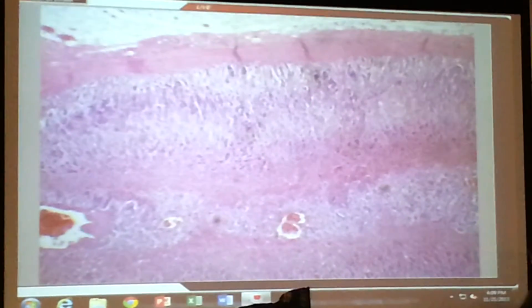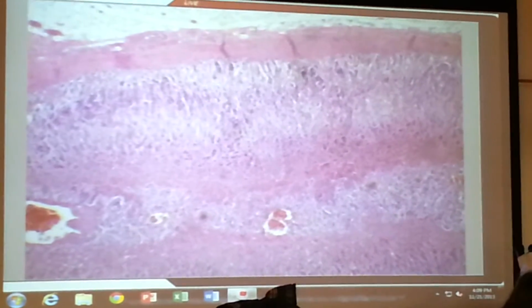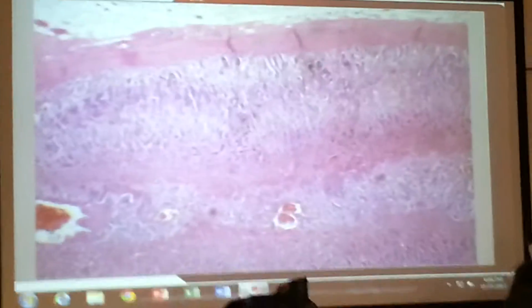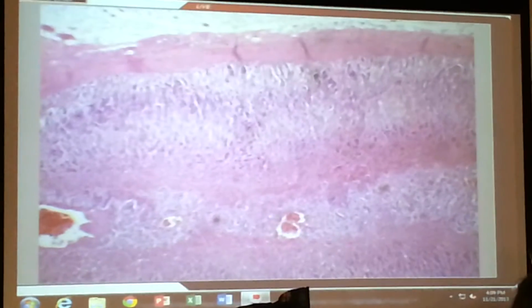So if you look at the adrenal gland, there are several stripes here, again, depending on how you cut it. All the way around the outside of everything, there's a capsule. So that is capsule, right? It looks basically the same as it does on testes or something else. So fairly thick capsule there. And again, you have an outside and an inside. We'll talk more about this in a second.